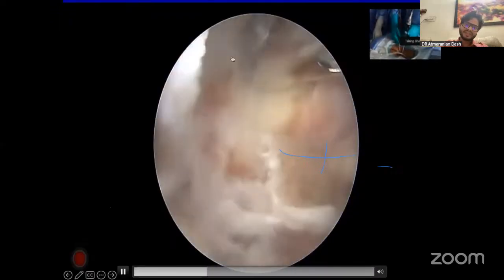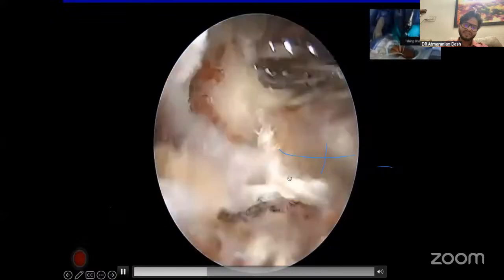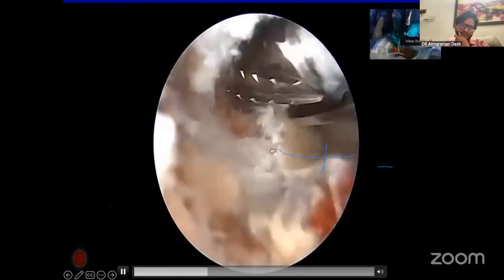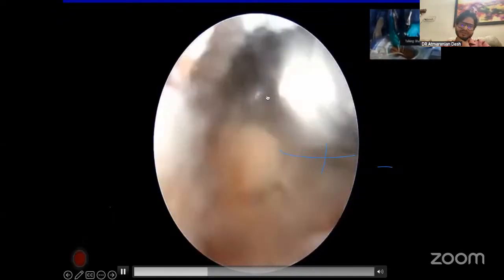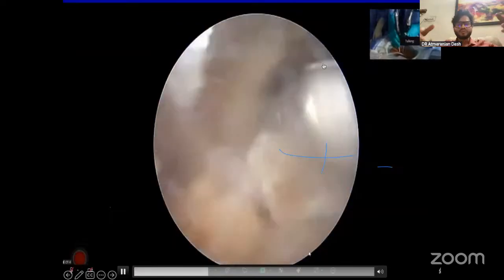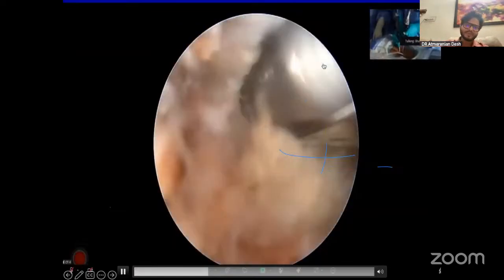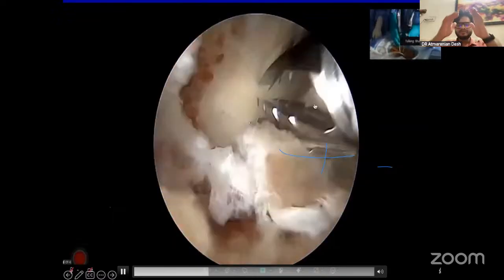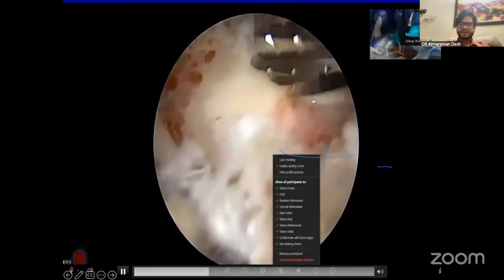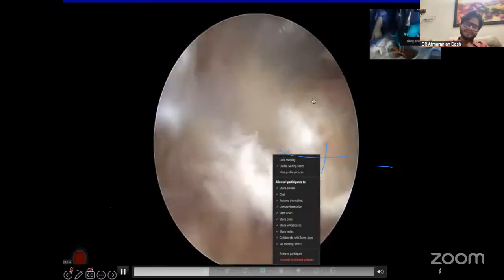So this is actually the C. I'm drilling the curvature, the apex curve of the C, and making a space at the base. You can very well see my hand movements. It is like laparoscopy of the spine. You have two ports, you just work like laparoscopy. So the flexibility, because we are bidextrous people, we can operate with both hands, which have different feelings from each other.